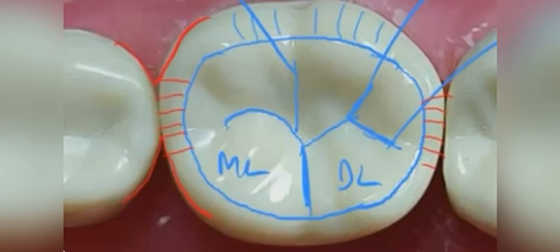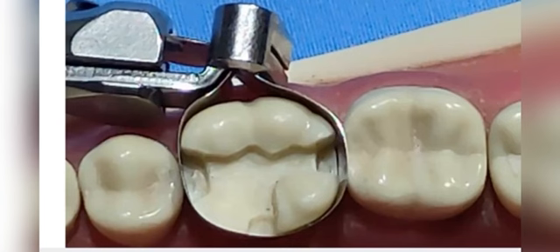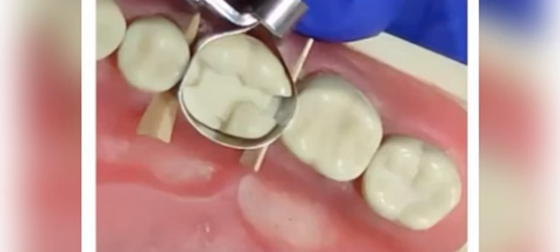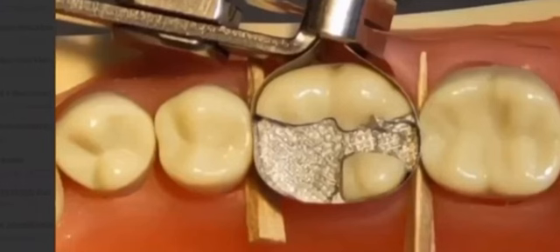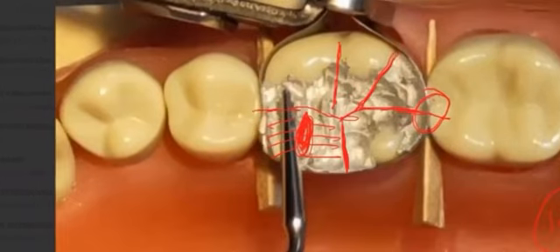Mesially, you can see it will have the contact which is a V shape, and the cusp is also having the curvature. So you need to create the same anatomy you can see in the clinical picture. So the kind of cavity you are getting is displayed over here. Double check the contact has been removed while you create the anatomy, and when you use the amalgam it should create the same.